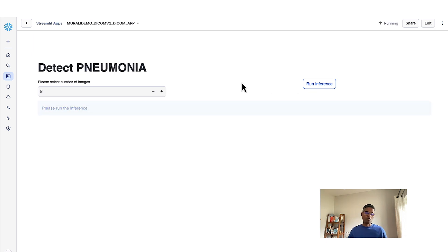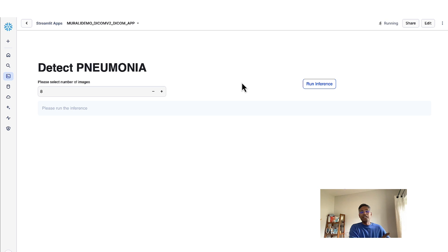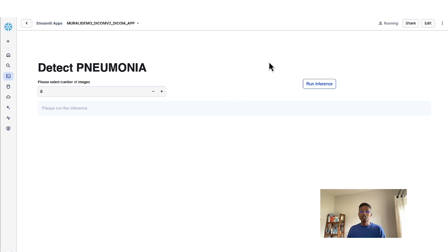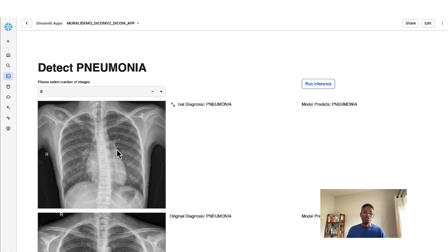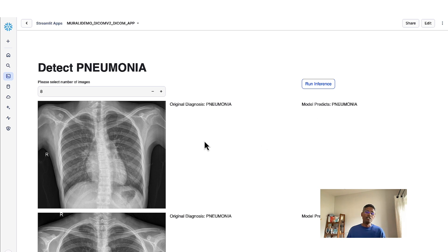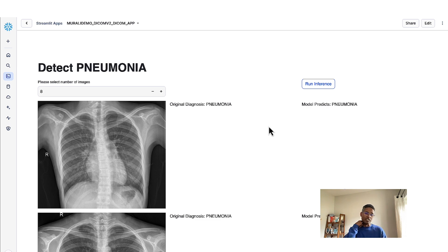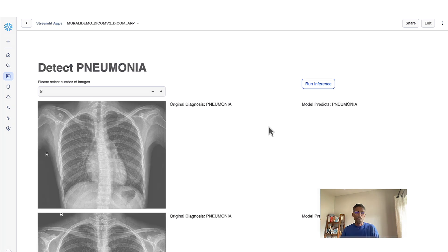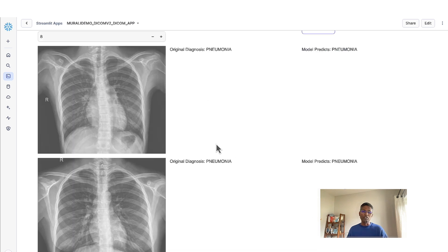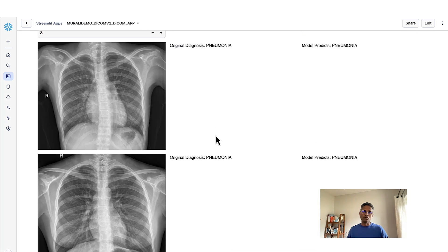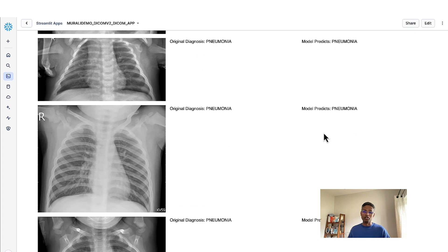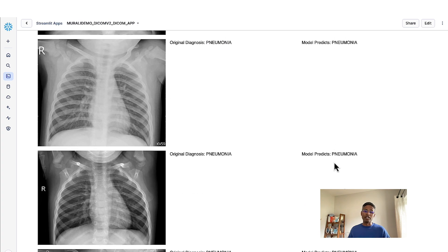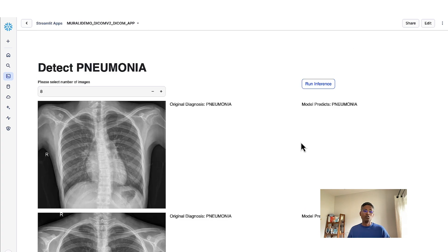At this point, we are taking those eight images, passing it as an input to the model that we have saved in the model registry, and it's now running to do the inference. Now, once done, you will see that here is the original diagnosis, and the model predicts pneumonia. Here, ideally, in a real world, we will have very unlabeled images, but in this case, just to show the validity and the efficacy of the model here, we are able to see that most of the images that are predicted with pneumonia, the model is also predicting as pneumonia.